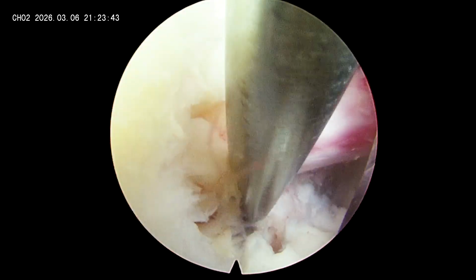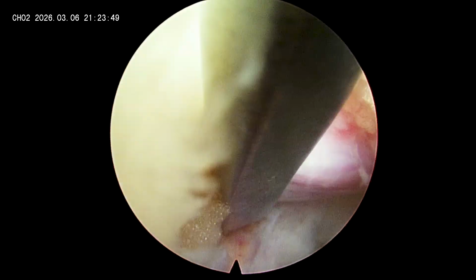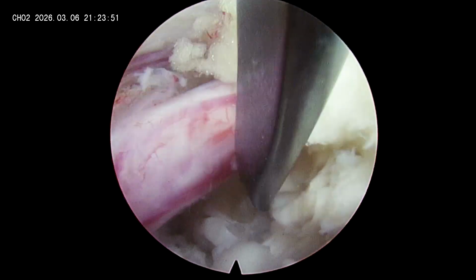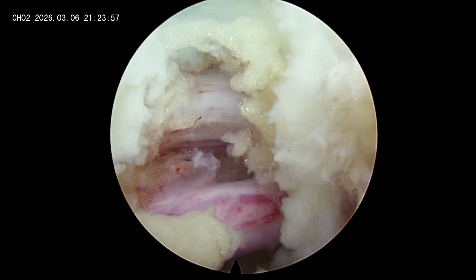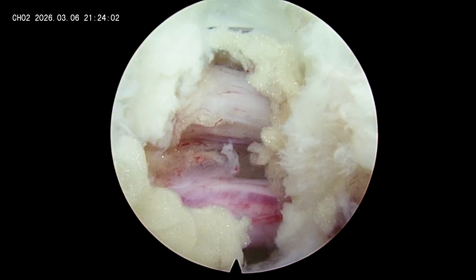Now this is the sort of final survey. Everything looks free here. So I could have easily saved around 5 to 10 minutes in this surgery. But as this is for demonstration purposes, I have shown detailed things here.